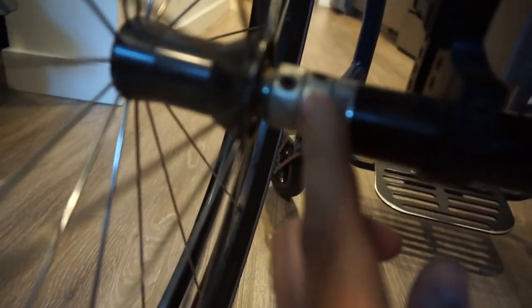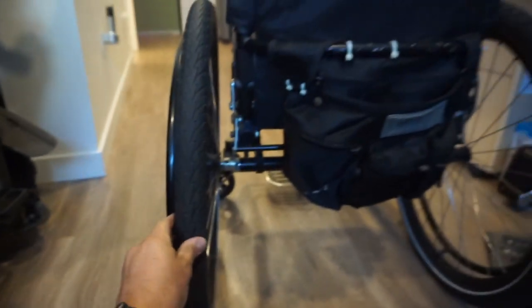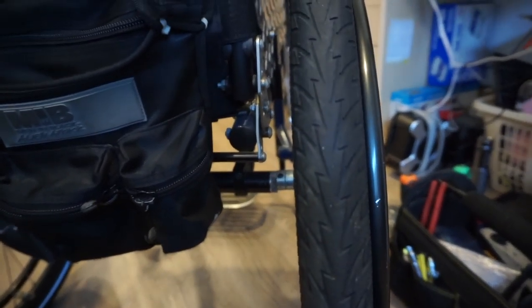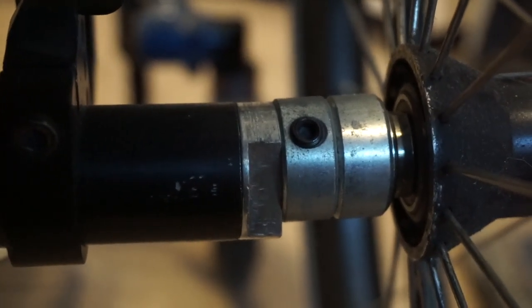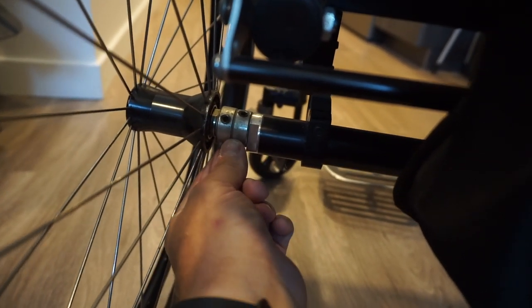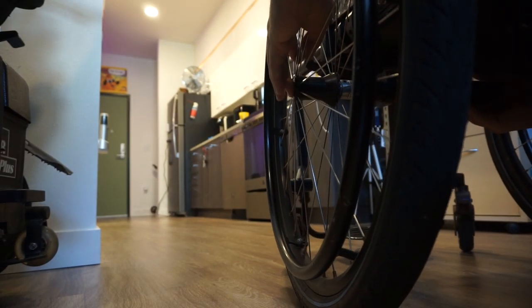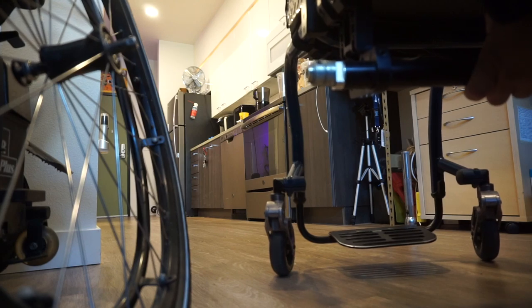Right now, when I set this chair up a long time ago I put these spacers on the axles, and I'm not exactly sure why. I don't need this much of a gap here — it's not like I'm running any crazy amounts of camber. So I'm going to remove one of these on each side. These are just generic motor shaft collars you can get from the hardware store with little set screws in them.